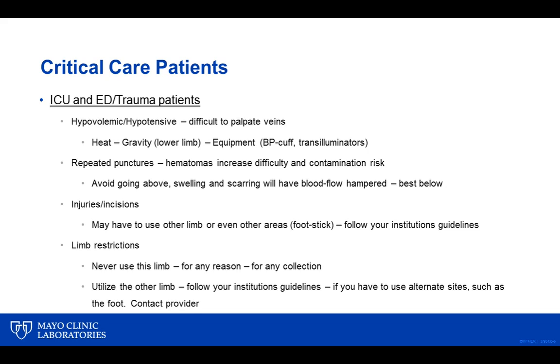Repeat punctures, you got to worry about hematomas. That increases chance of contaminating your sample. And what do we need to do about that? How can we still use that area, and what equipment do we need to do that? Avoid going above swelling or scarring, having blood flow hampered. What's best? What's best for that patient? What's best for a quality sample?